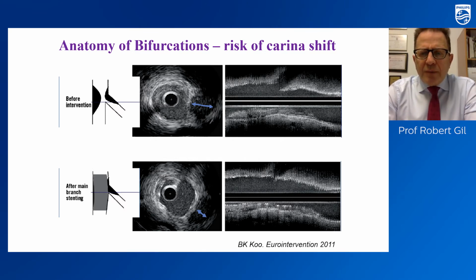Here you can appreciate a longitudinal projection. You see here the distal main vessel. This is the proximal main vessel. This is the side branch.